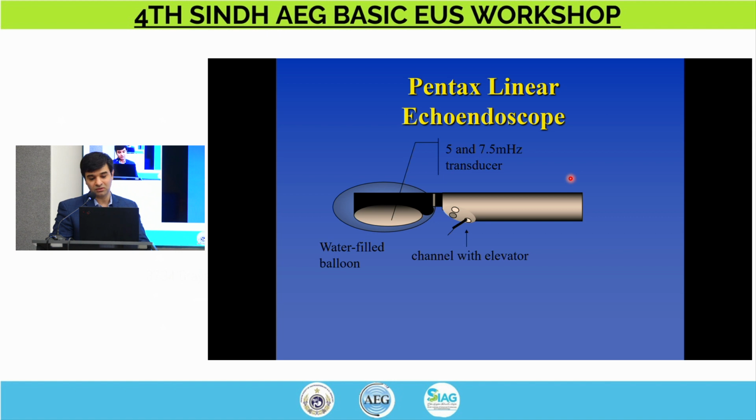Now, different echo endoscopes are made differently. This is a Pentax echo endoscope. The general constitution is quite similar. So here you see the transducer. This is what contains those crystal elements that emit the ultrasound waves. Your scanning occurs in a linear fashion away from here.